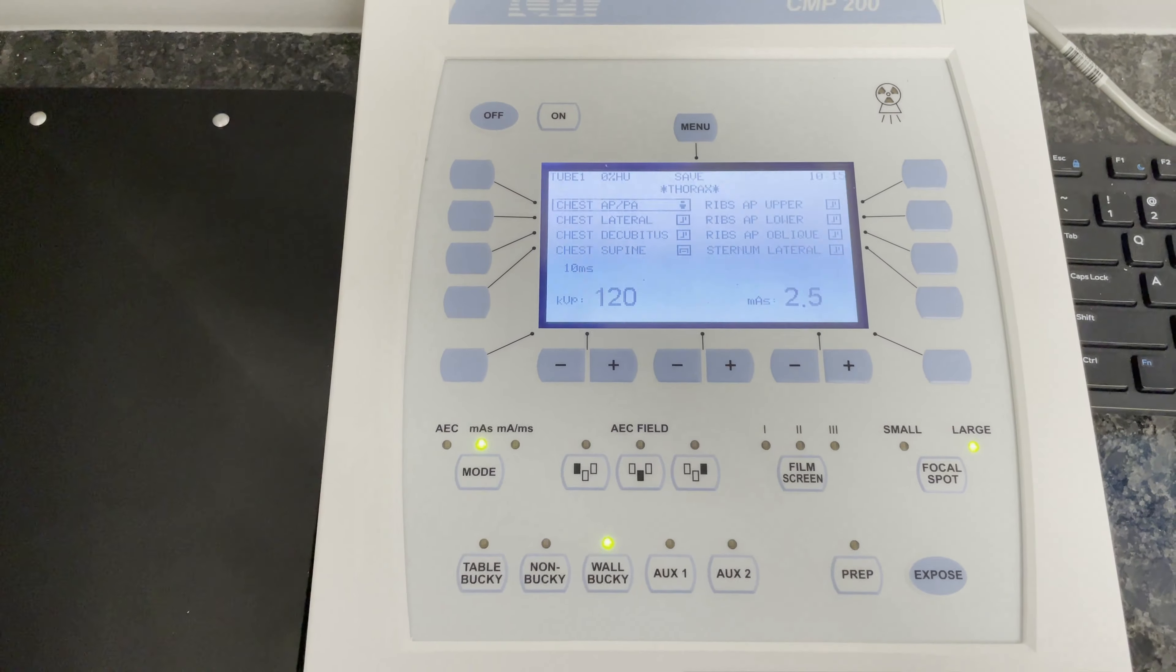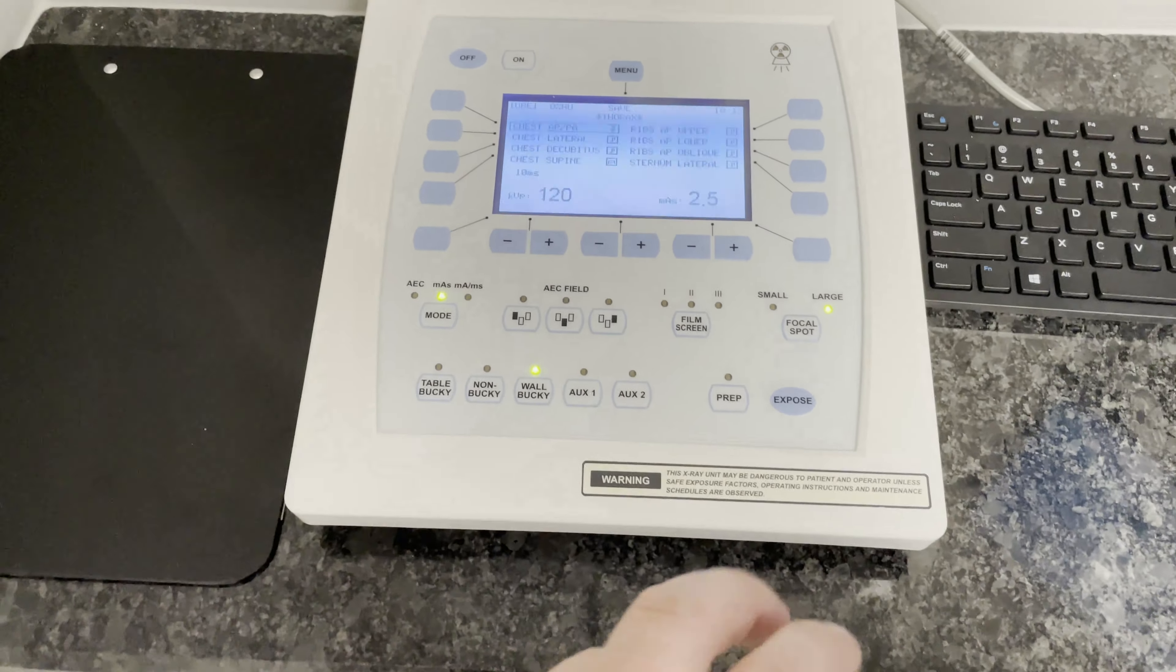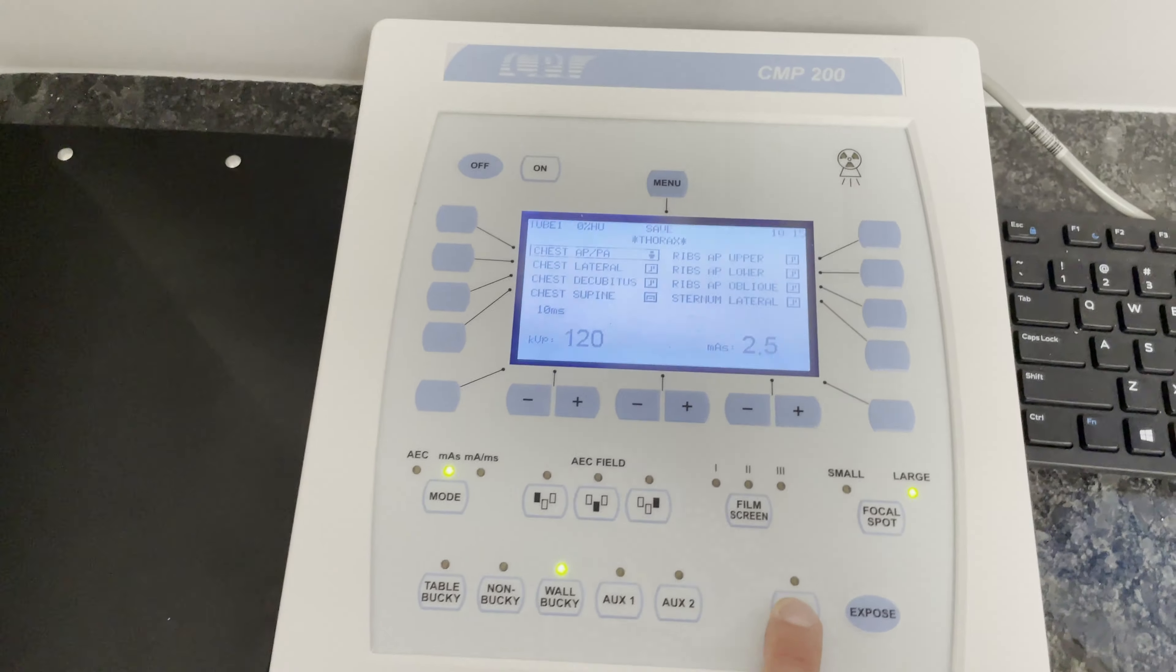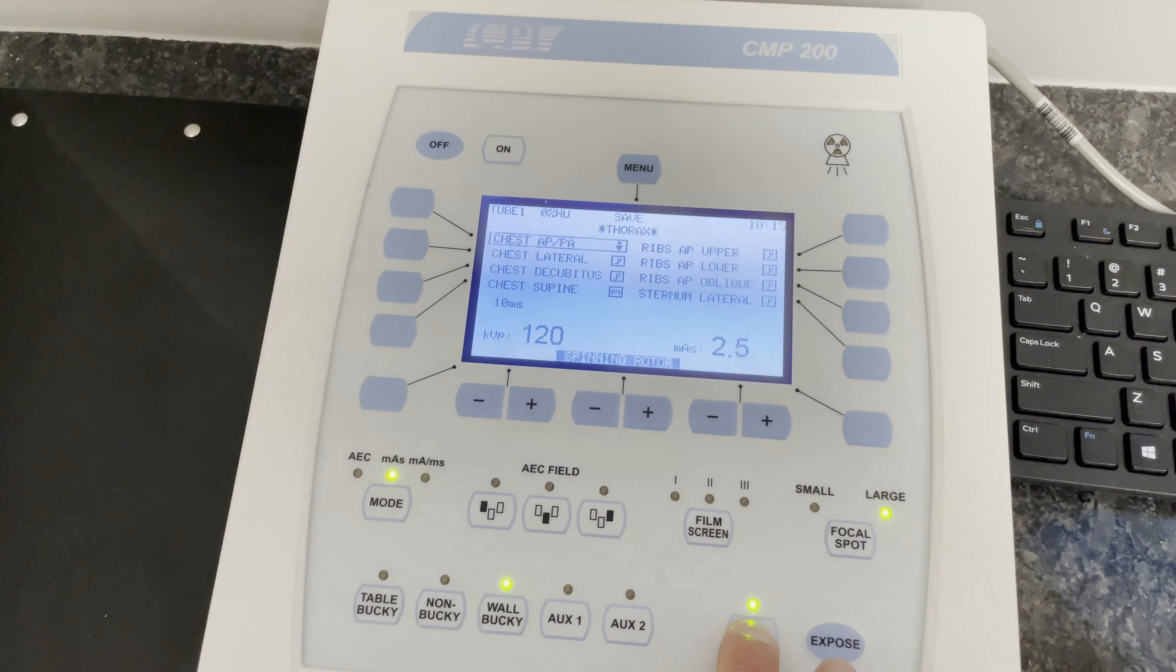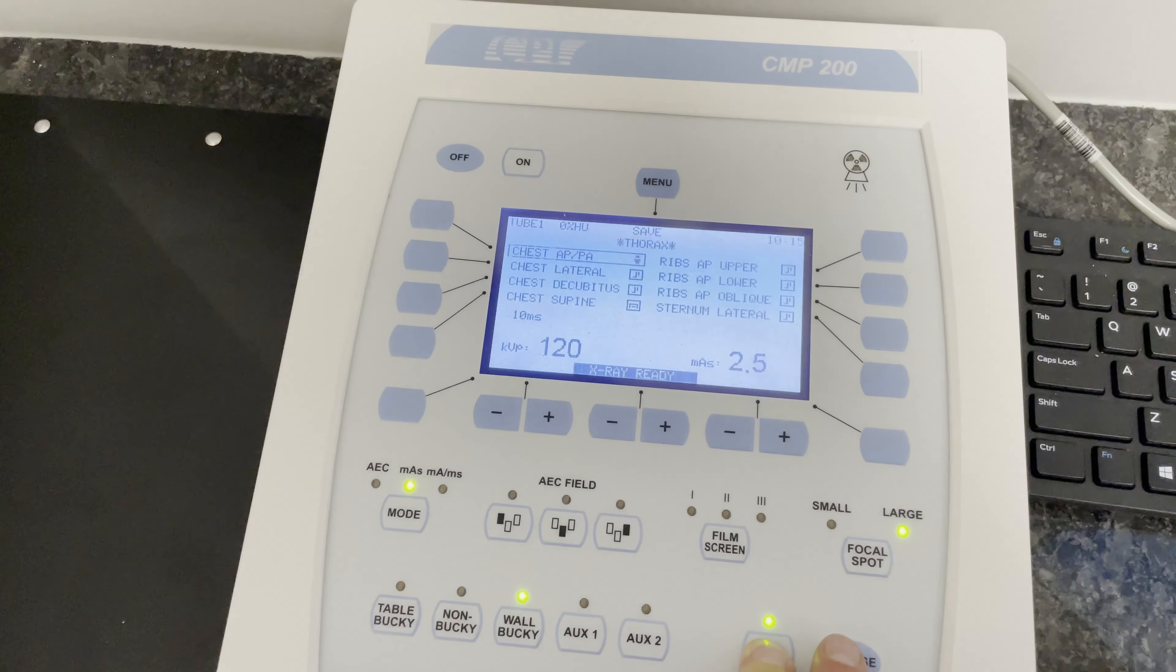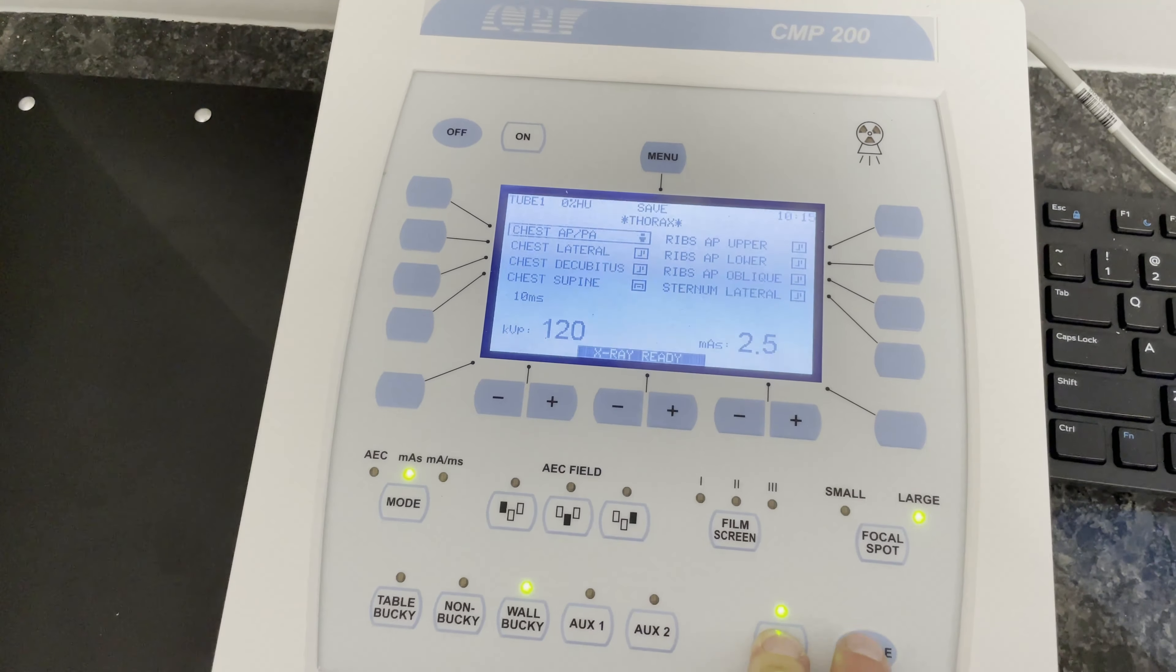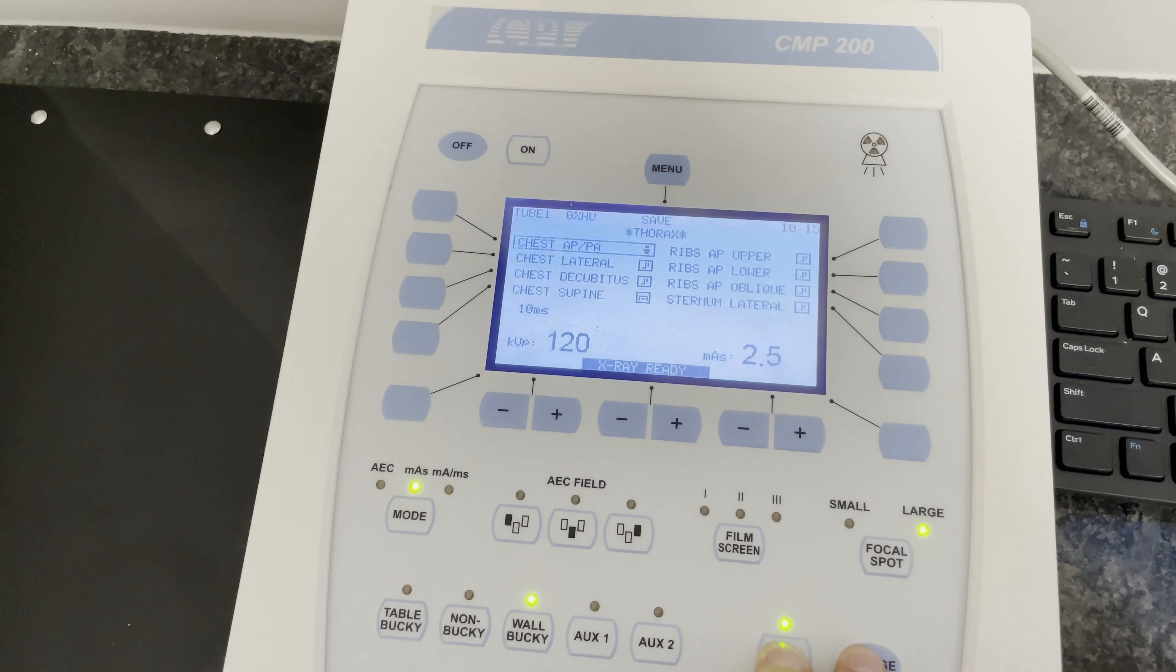Once you've set that, all you have to do is click the prep button. You'll be holding down the prep button and as soon as you see it say x-ray ready, click expose.